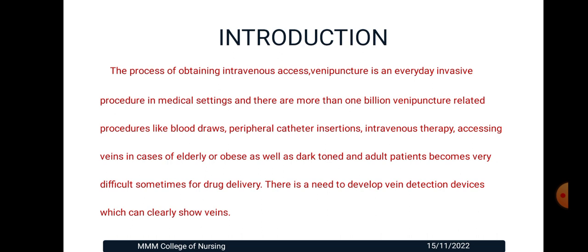Accessing veins in elderly or obese, as well as dark tone and adult patients becomes very difficult sometimes for drug delivery. There is a need to develop vein detection devices which can clearly show veins.